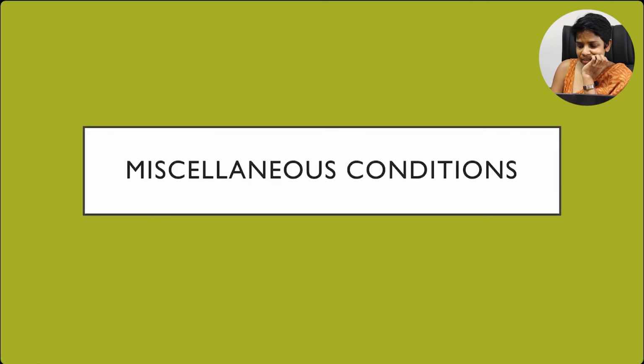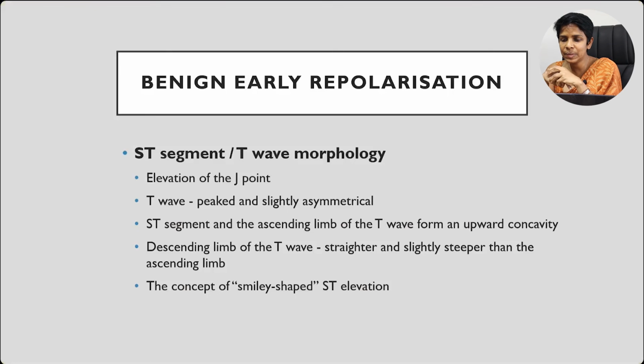I have come to the last part of my presentation. I want to highlight these few conditions because these are some of the pitfalls we find when we try to interpret ECGs. One is this benign early repolarization. Believe me, even us, the consultants, have detected these conditions as ST elevation MI. So it is important to note these changes.